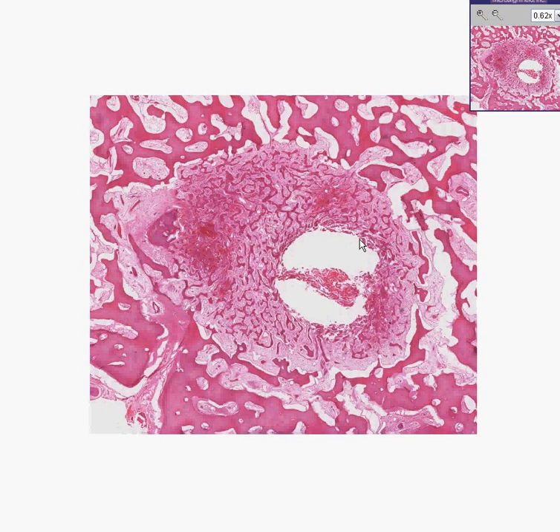It's a benign tumor. If it was not a benign tumor, it wouldn't have the name osteoma. It would be an osteosarcoma. In almost every osteoid osteoma, which this is, you see a central portion, like you see here, which is called a nidus, N-I-D-U-S, meaning this is the seed upon which the tumor grew. This is the nidus of the osteoid osteoma.